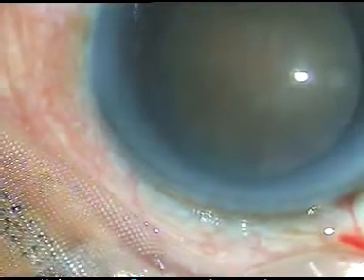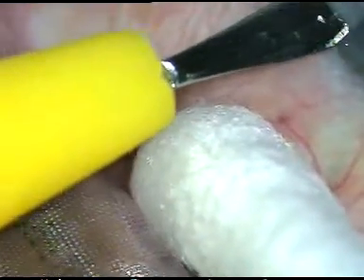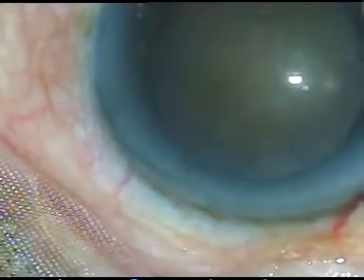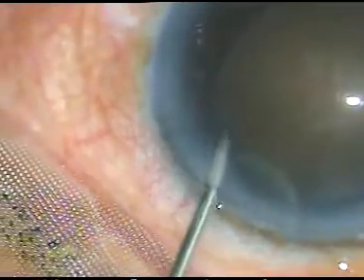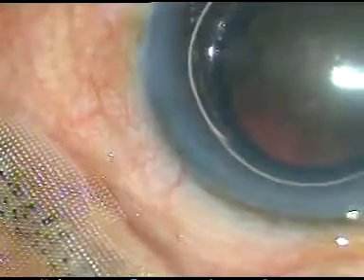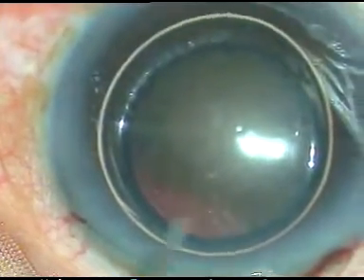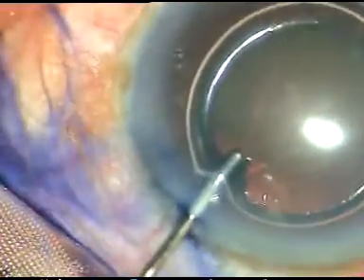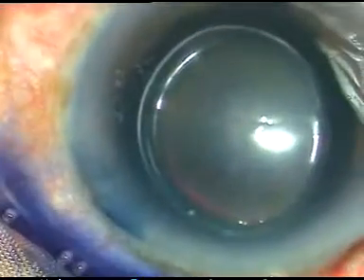By this time, the main incision and one side port on the left side of the main incision have been done. Now, a big air bubble is injected into the anterior chamber. I want to stain the anterior capsule of the cataractous lens with trypan blue dye so that I can do a large rhexis.